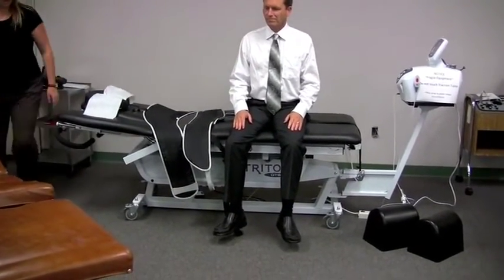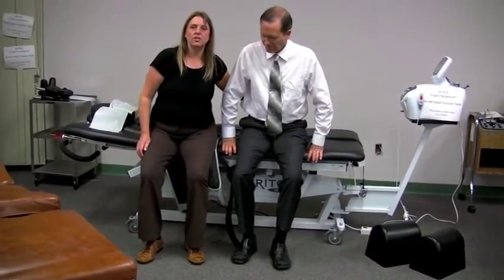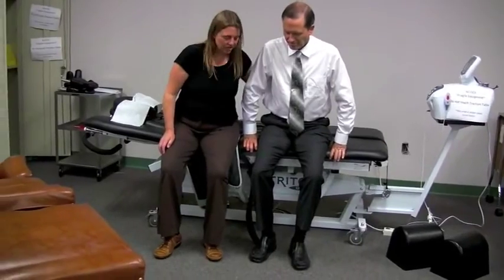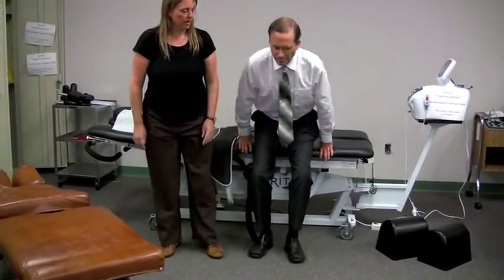So let's have you just come to the edge of the table and just sort of slide off diagonally. And then in this position is where the patient's muscles are re-engaging, so you're beginning to use your muscles. And then just keep your back straight and come up very carefully. Does that feel good? Good, excellent.